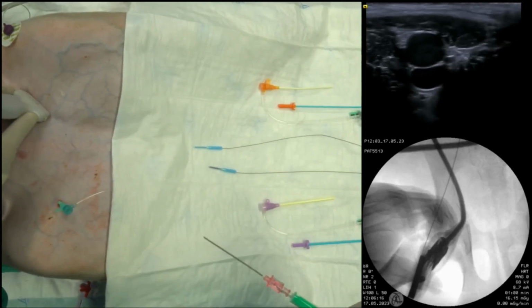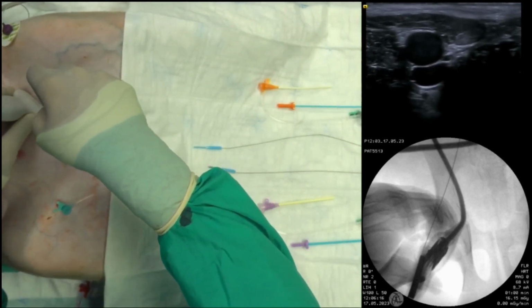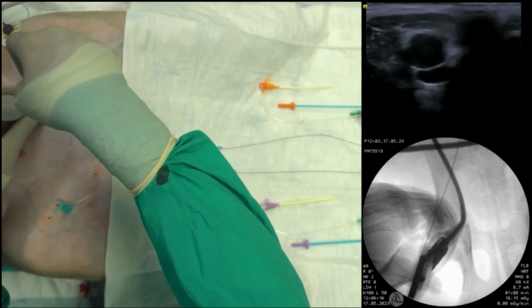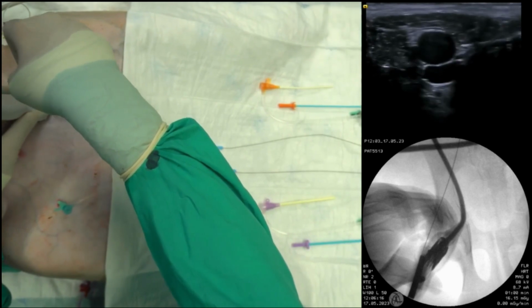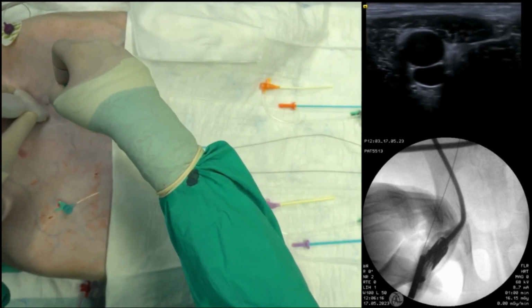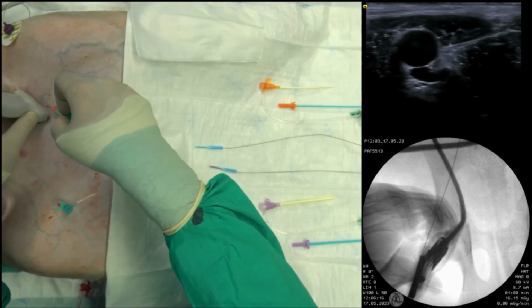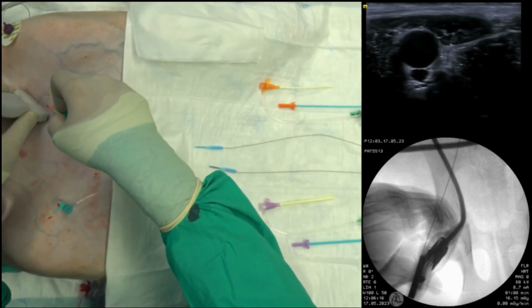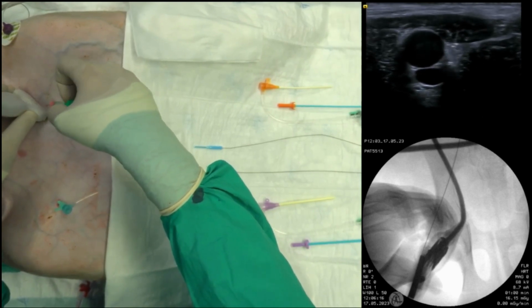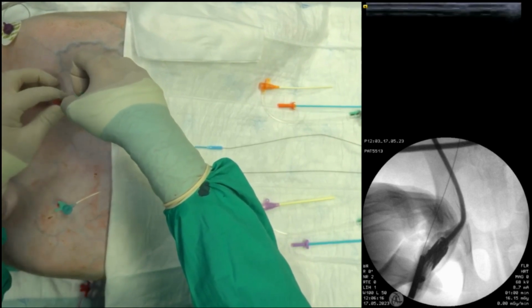So here we first identify the femoral artery and femoral vein using ultrasound, and you can do this by looking at the artery and seeing that first it's pulsatile and it does not compress under pressure, while the vein, when you apply pressure to the skin, decreases its size. Then under ultrasound guidance, we advance the needle with a syringe on its hub until we are at the vein wall. And once we puncture the vein, we make sure that we are able to aspirate blood easily. If blood is not easily aspirated into the syringe, then you need to reposition the needle.